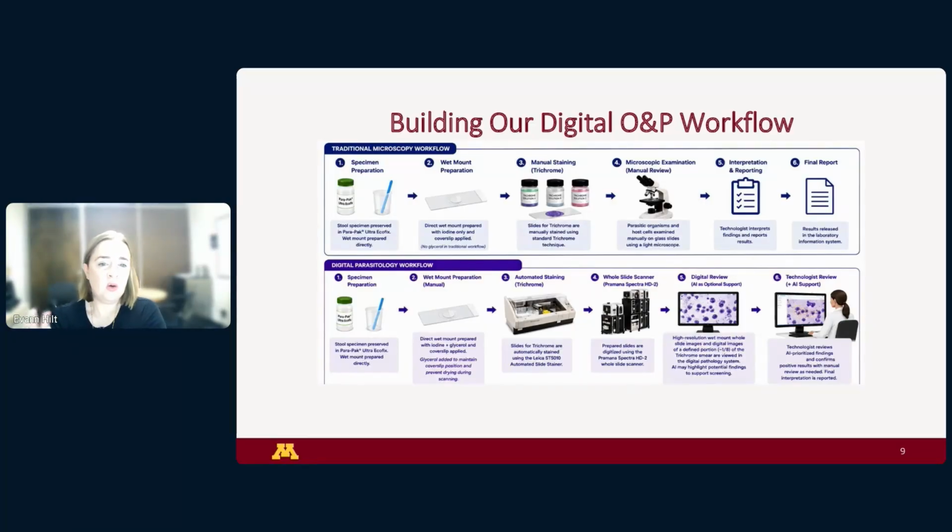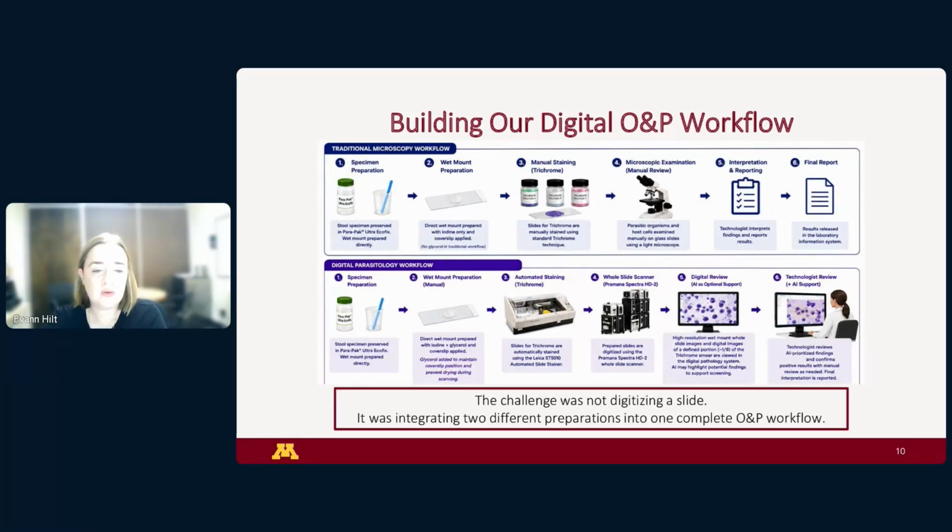So what I will reinforce throughout this whole thing is that the AI is not replacing our expertise. It is a tool that we are using to help us be more efficient and have a better workflow. And so the challenge here is not necessarily digitalizing the slide itself, but integrating these two different preparations and using this technology to help complete the ova and parasite workflow itself.